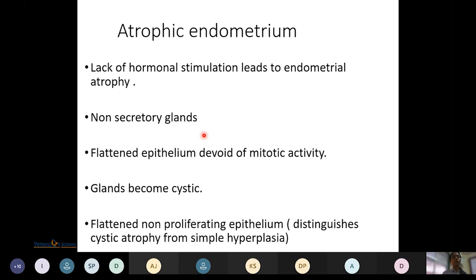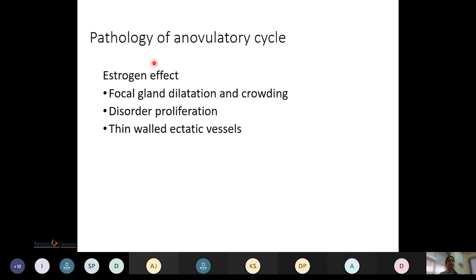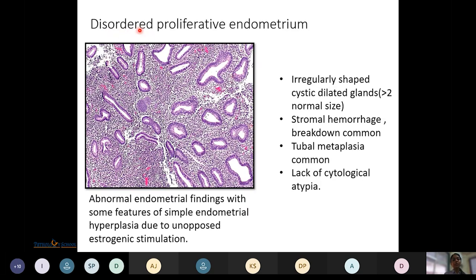Atrophic endometrium results from lack of hormonal stimulation; there are non-secretory glands, a flattened epithelium devoid of mitotic activity, and glands become cystic with flattened non-proliferating epithelium. This helps differentiate atrophy from hyperplasia. Anovulatory cycle pathology is due to estrogen effect without progesterone (as corpus luteum does not form), resulting in focal gland dilatation and crowding, disordered proliferation, and thin bald ectatic vessels. Disordered proliferative endometrium can result from an anovulatory cycle and may progress to hyperplasia.